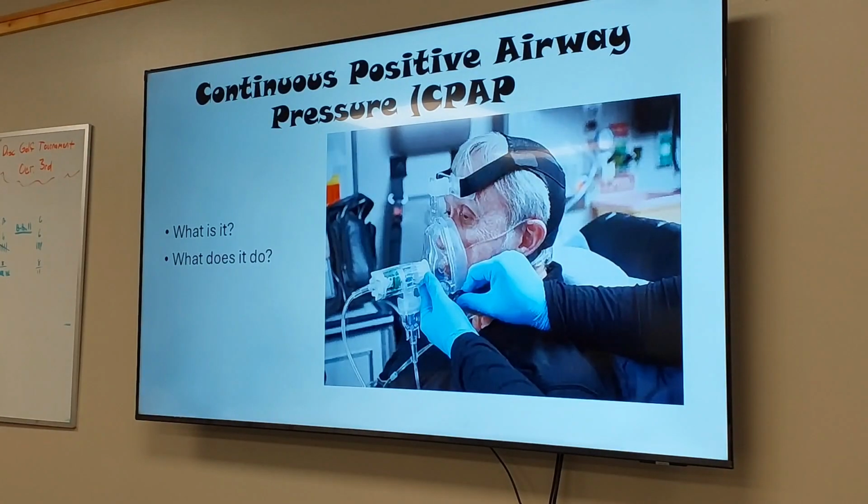Talk a little bit about CPAP. CPAP is considered a non-invasive ventilation. How it works is it delivers a continuous stream of air. So CPAP, continuous positive airway pressure, right? And it helps keep your airways open and improve your gas exchange down to your alveoli.